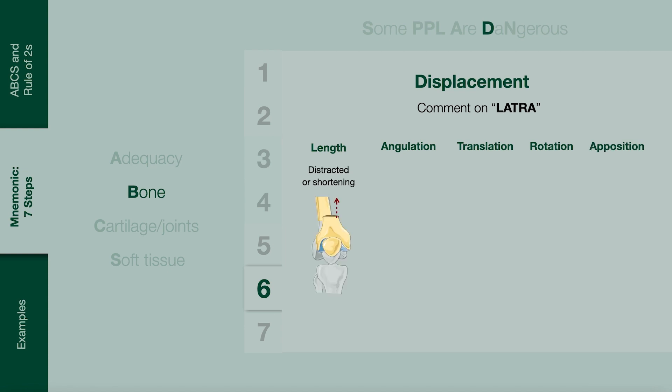Length. When commenting on length, comment on whether the fracture has caused shortening (decreased length) or distraction (increased length). This is an example of fracture shortening. Angulation. Comment on the angulation by describing the distal portion relative to the proximal portion of the fracture. This is an example of posterior tilt of the distal femur. Alternatively, this can be described as apex anterior angulation.